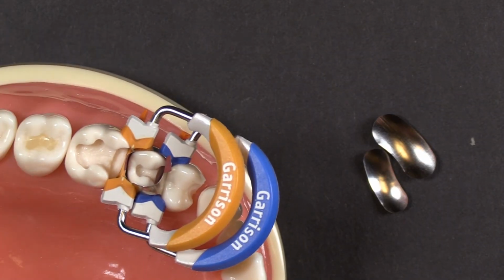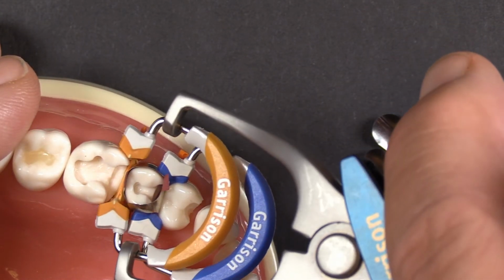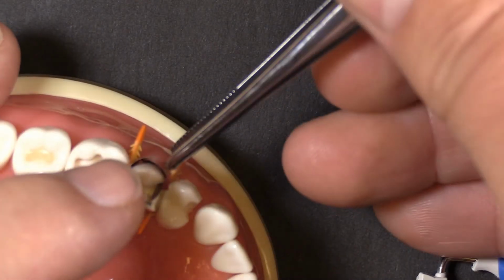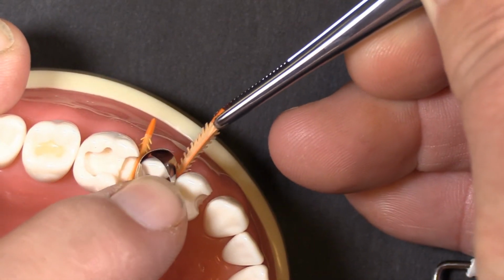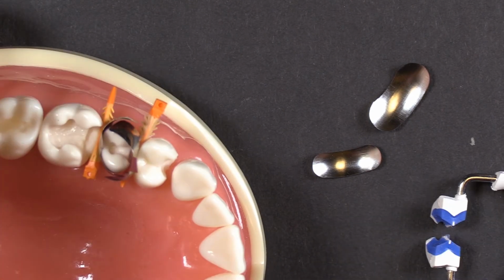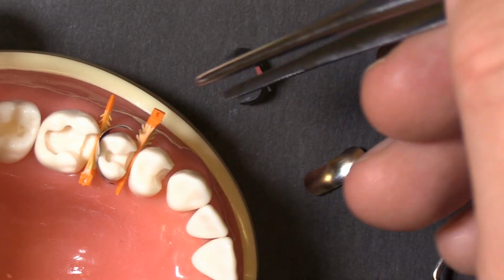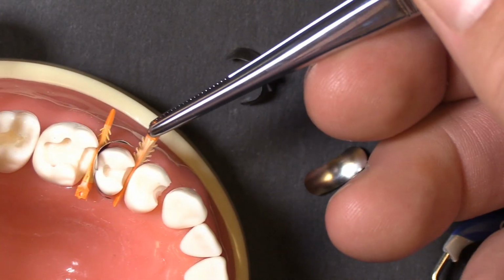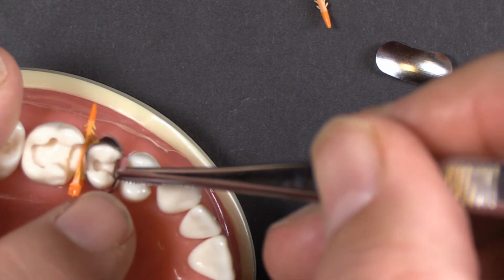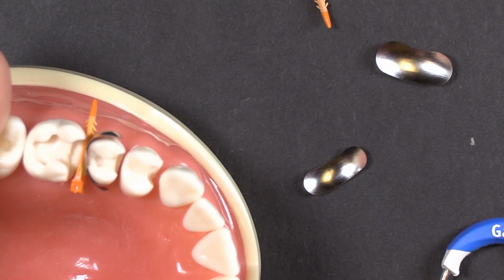Okay, so I dislodged this again just a little bit here, didn't I? You can see what we're talking about with these rings, the bands interfering with each other a little bit. I twisted that out of shape when I wedged it. That's a common problem. If you don't have the wedge, see, I did not have the wedge firmly engaged with the bottom of the band, and therefore when I went to place the ring, the band was not truly held in place. Let me get a new one here.